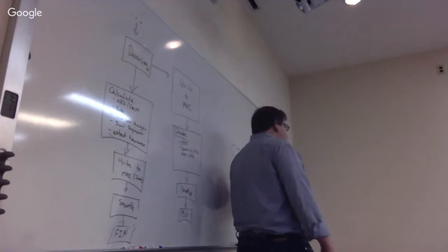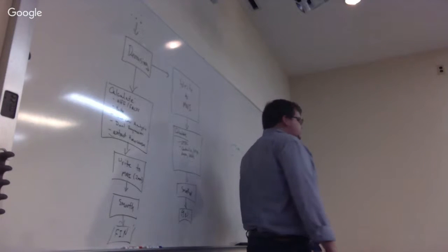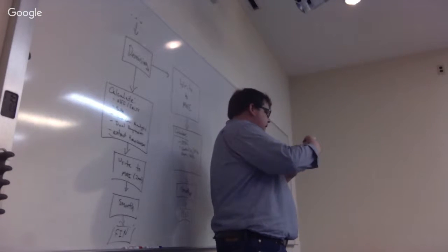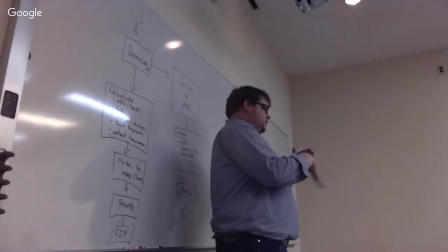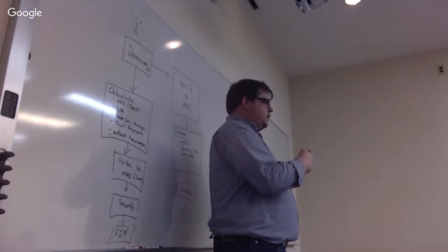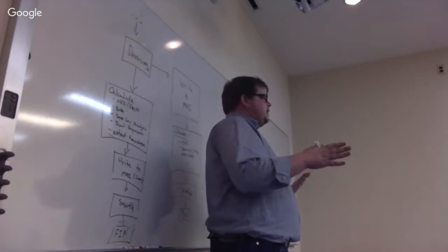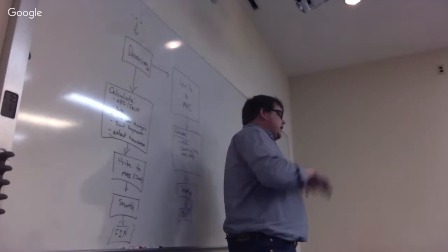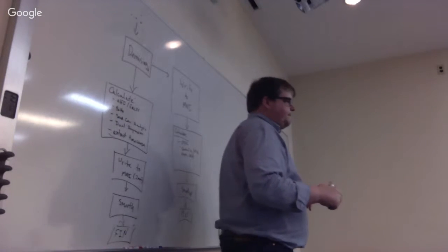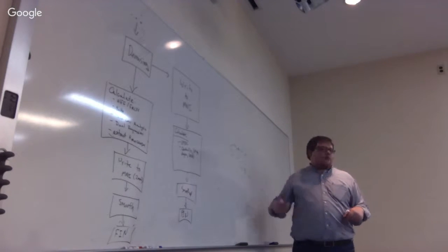So rather than smoothing with 6 millimeters, we smooth to 6 millimeters, right? AFNI does this, and it's an iterative procedure. What you do is you calculate the smoothness of the data, you take the smoothness that you want, and you calculate an operator that will make it more smooth. And you do that until the data matches closely with the smoothness that you want, right? That's not easier, but it's better than just constructing a Gaussian that's 6 millimeters and applying it, where you're assuming you're going to have an effective 6 millimeter. Right, yeah. So our goal is to make this number what's on the outside.